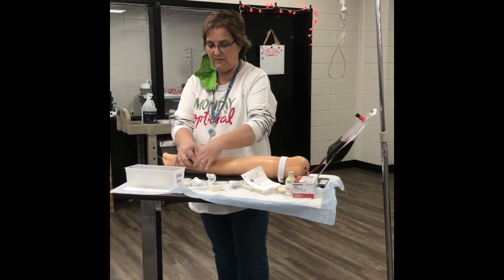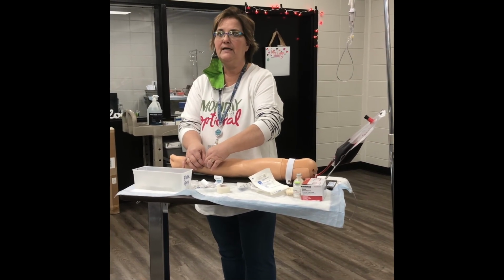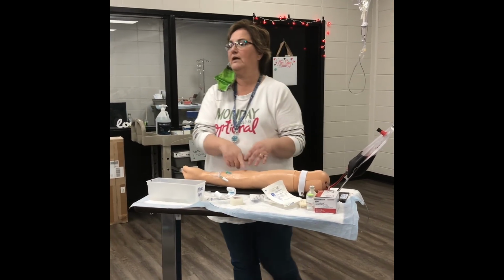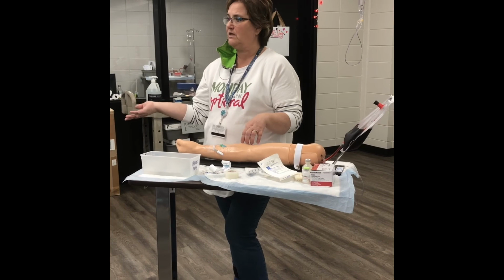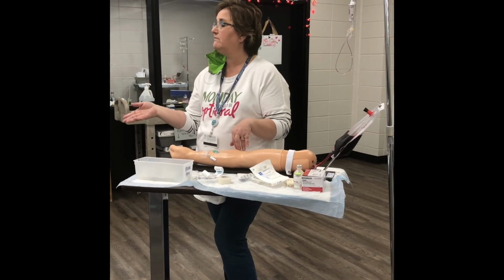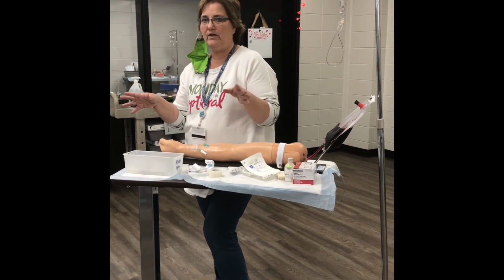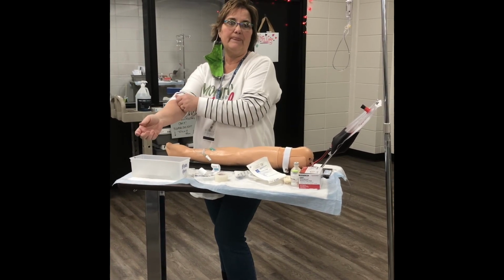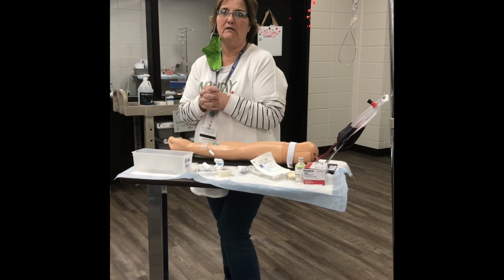Last thing you need to do is make sure you clamp this off, all right? Clamping it off is what keeps it from clotting off between when I'm fooling with it and when a nurse comes to give medicine, or when the next nurse comes to flush it, or whatever they're gonna do. If you leave it unclamped, chances are it's gonna clot off, which means they're gonna have to be stuck again.